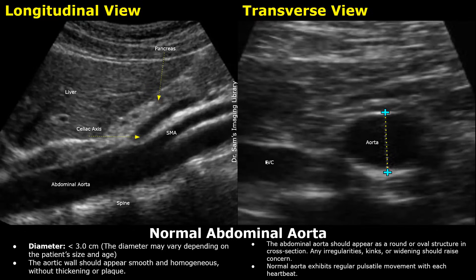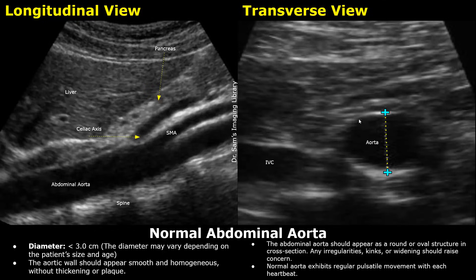The normal diameter of the abdominal aorta is less than 3 cm. It can vary depending on the patient's size and age. The normal aortic wall should appear smooth and homogeneous. There should be no thickening or plaque present.